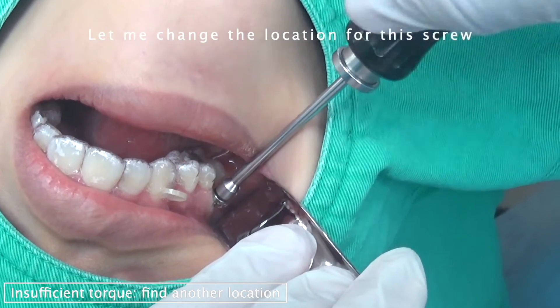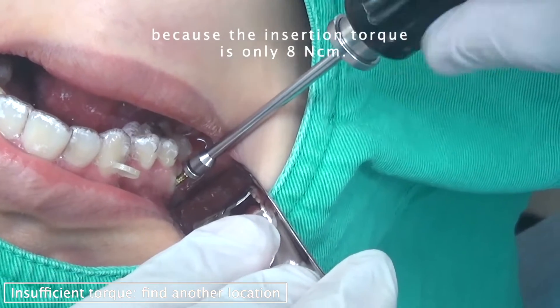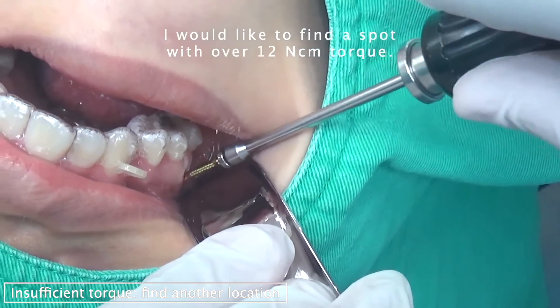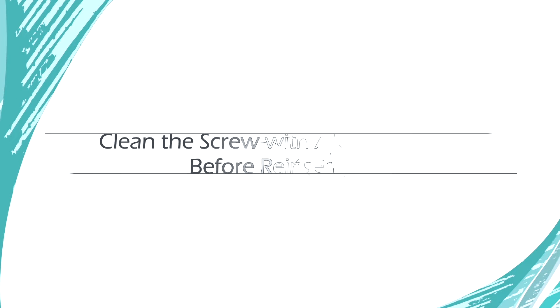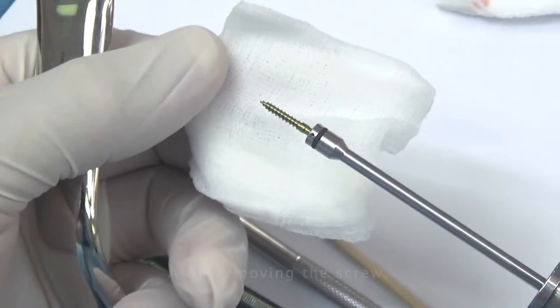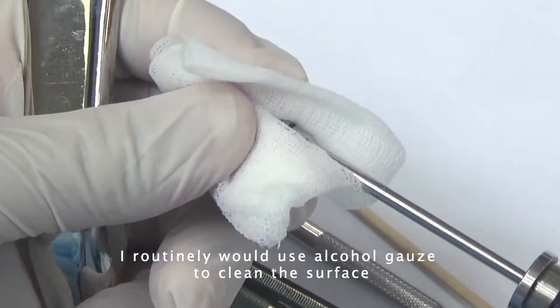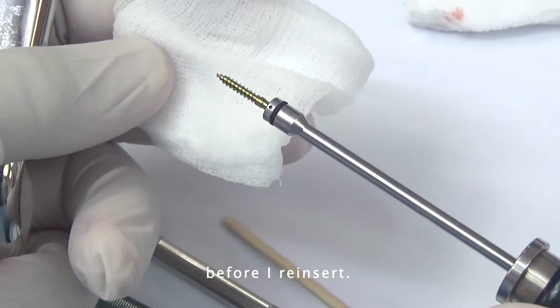Let me change the direction because the insertion torque is only 8 Newton-centimeters — I would like to find a spot with a torque over 12. After you remove the screw, I routinely use an alcohol gauze to clean the surface before I reinsert it.